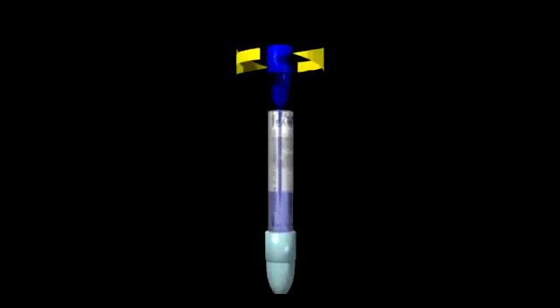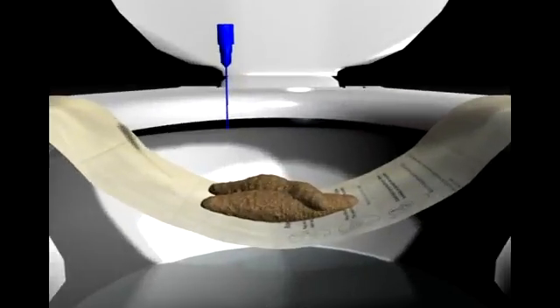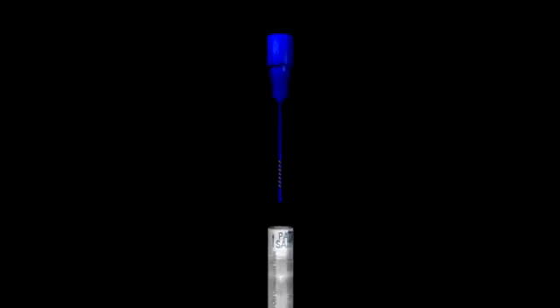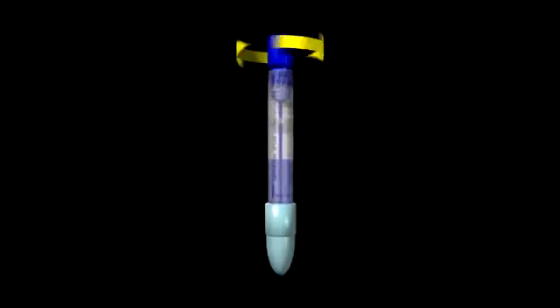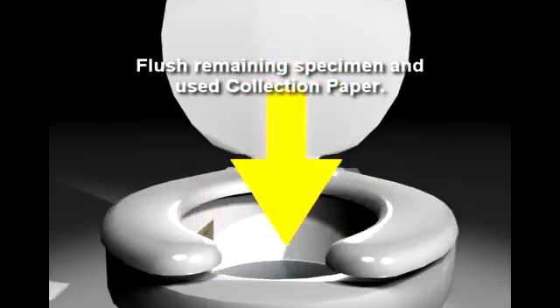Unscrew the sampler from the collection tube. With the fecal specimen still on the collection paper, randomly pierce the specimen with the grooved end of the sampler in at least 5 different sites. Insert the sampler back into the collection tube and firmly tighten it. Shake the tube to mix the specimen and the FOB buffer. Flush remaining specimen and used collection paper.